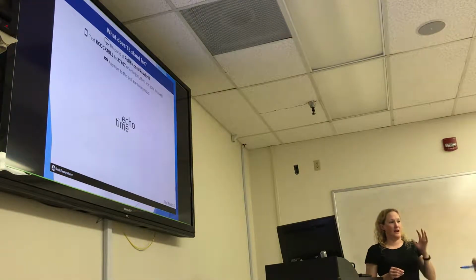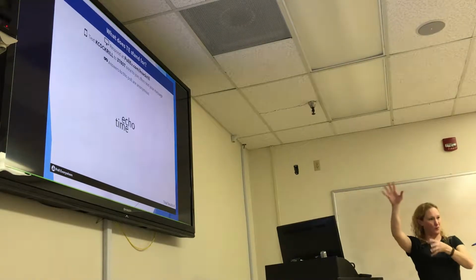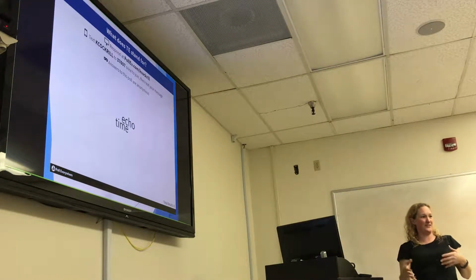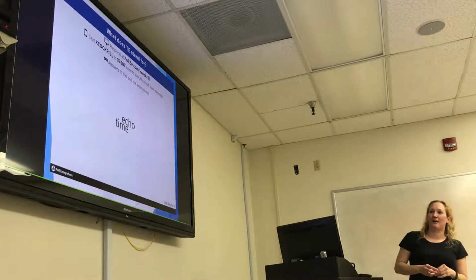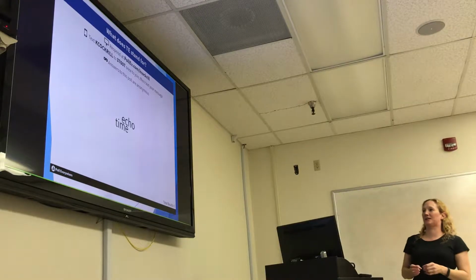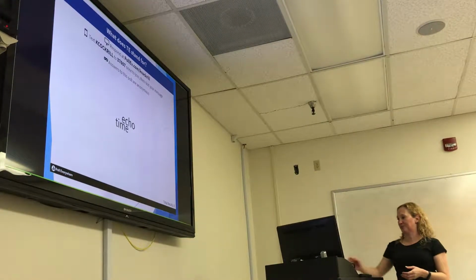So yes, echo time. And again, that's the time from exciting slice 1 to collecting the echo. It's kind of right there in the name, right? It's the echo, it's the signal, okay? So maybe that can help you to remember it. It's right there in the name, the echo time, okay?